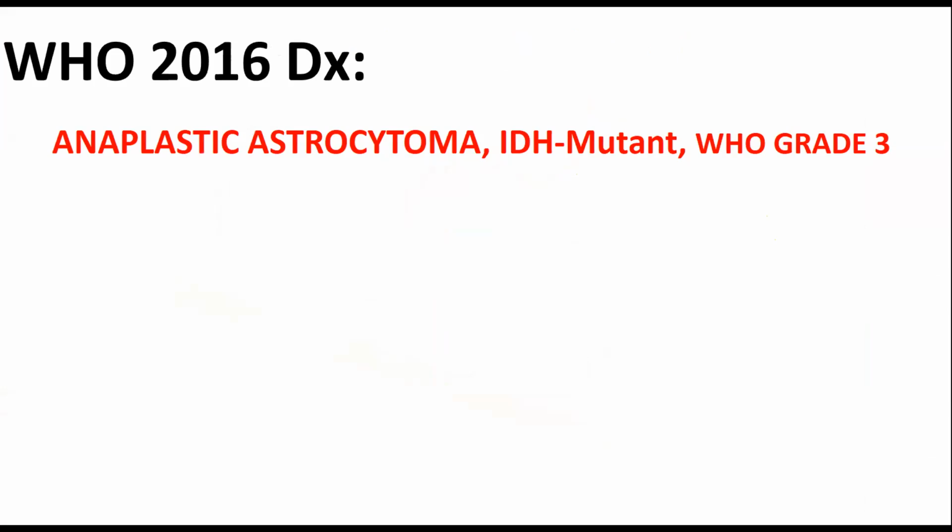Let me add just a quick footnote here. In many cases, ATRX expression can be lost and there's no mutation. In probably most cases, there is an ATRX mutation. So don't take that there usually is not. Many cases, most cases, there is. Okay. All right. WHO 2016 diagnosis for this case: anaplastic astrocytoma, IDH mutant, WHO grade 3.